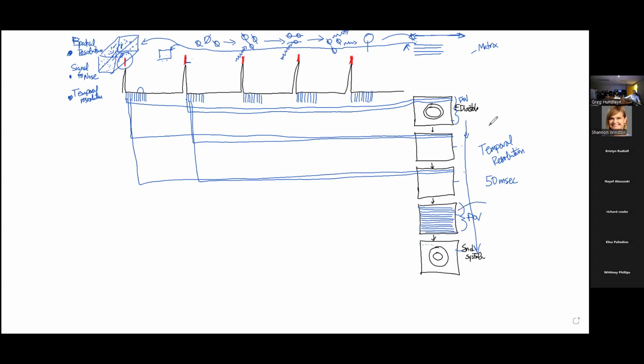We talked about that in things like 256 by 256 or 128 by 128, right? We talked about matrix sizes kind of in that range. So that means we need 128. If we pick this one right here, we need 128 of these lines, right? To make one of the frames of the movie.